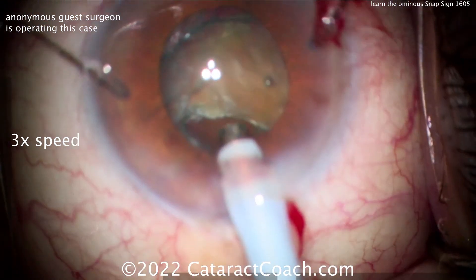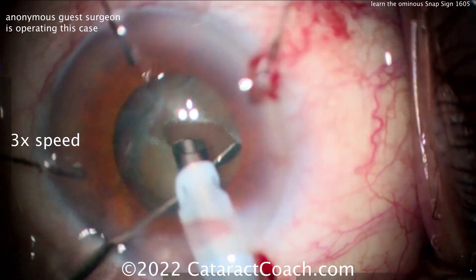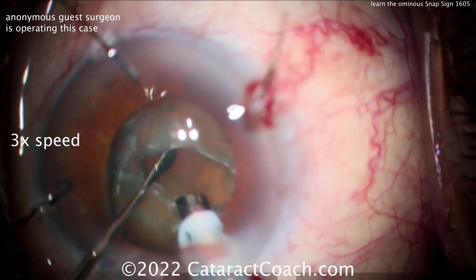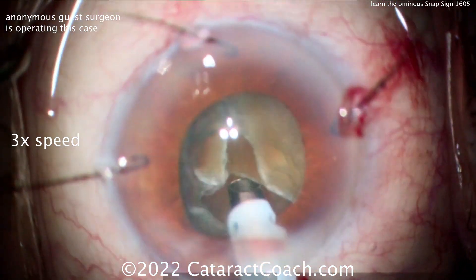Notice how the nucleus has a hard time rotating — that's an ominous sign. Now look, there's a gap between the nucleus and the iris; look how deep it goes in the eye, and deeper still — this is already gone. It won't rotate. There's a gap because the nucleus is falling posteriorly.